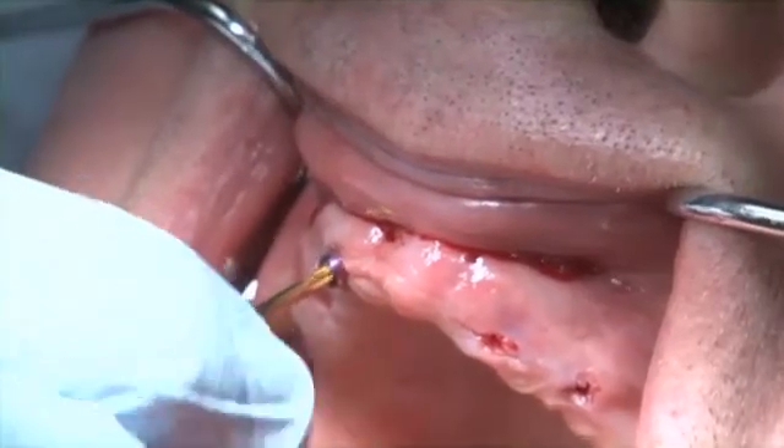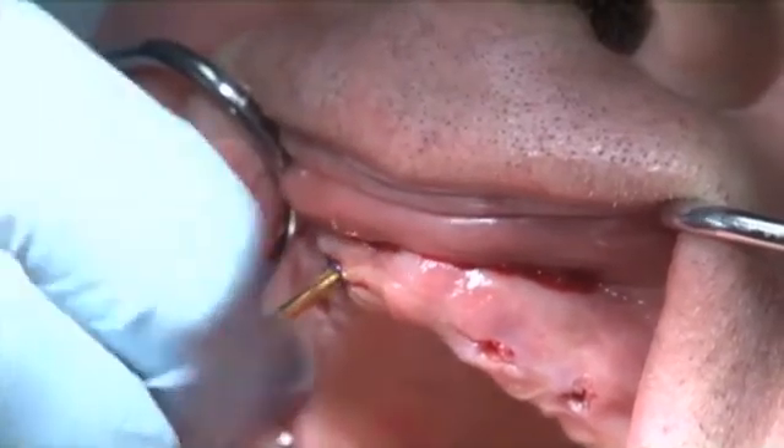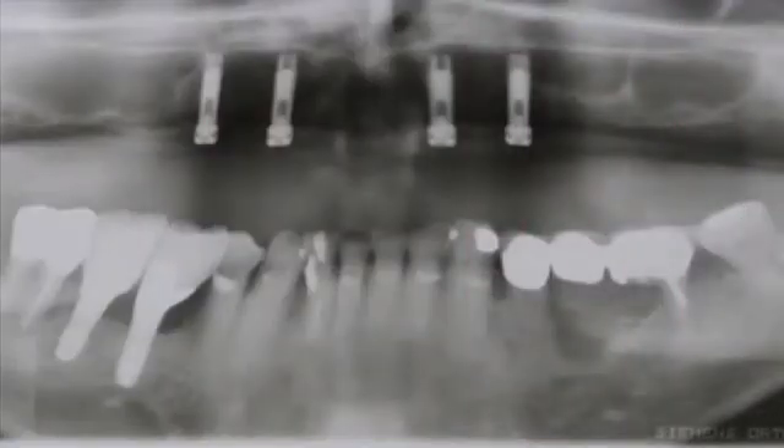Figures 19 and Video 6 show the conventional panoramic radiograph showing proper positioning of the dental implants. You can see that they are very parallel, which will give us very good retention of our attachments.